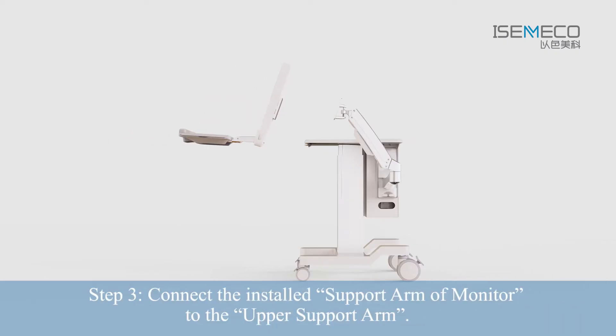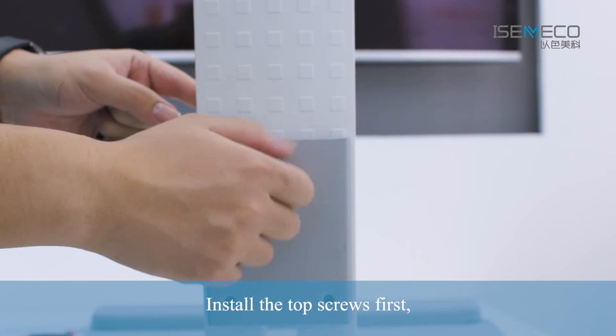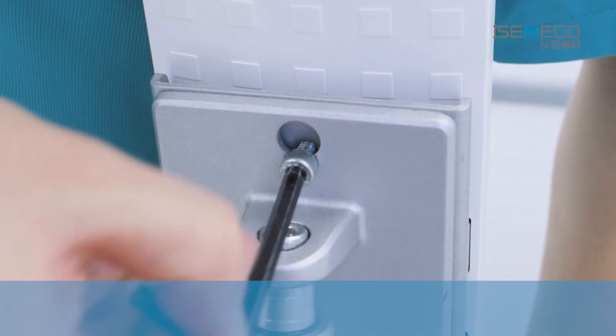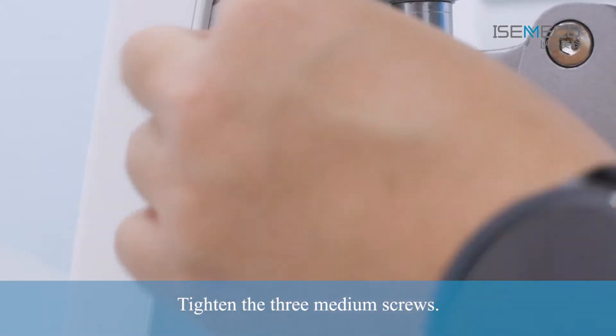Step 3: Connect the installed Support Arm of Monitor to the Upper Support Arm. Install the top screws first, then hang it into the corresponding bracket hole. Tighten the three medium screws.